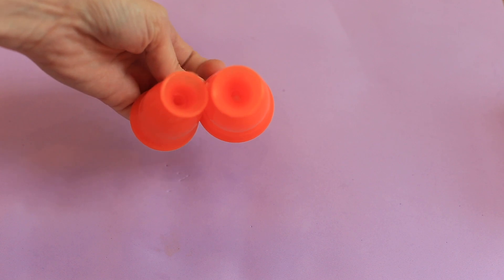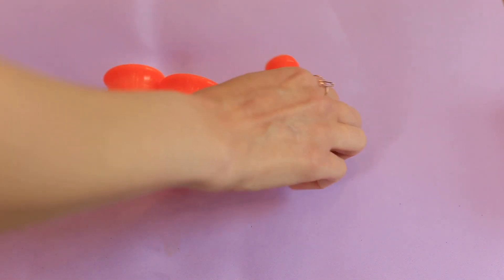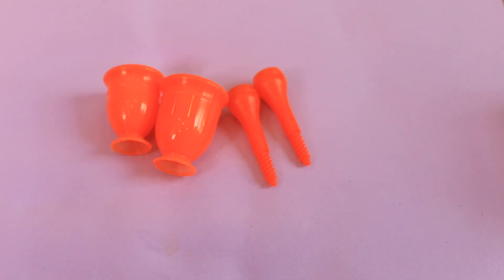Thanks to a Reddit post, I discovered a brand called Amy Cup Vitality, which is what you see here. It is a menstrual cup and it comes with this device. The post didn't really say what the device did, and the website was also no more clarifying. So being the menstrual cup enthusiast that I am, and curiosity was killing me, I decided to order one of each size.